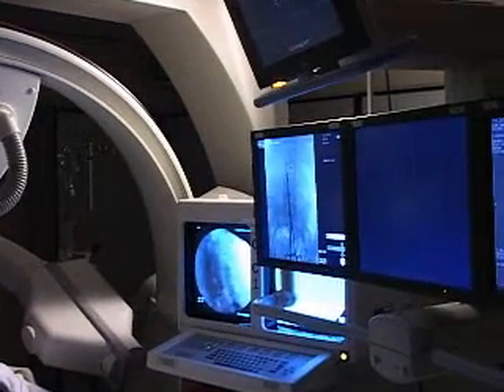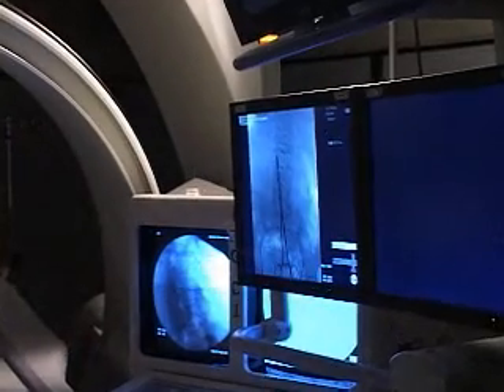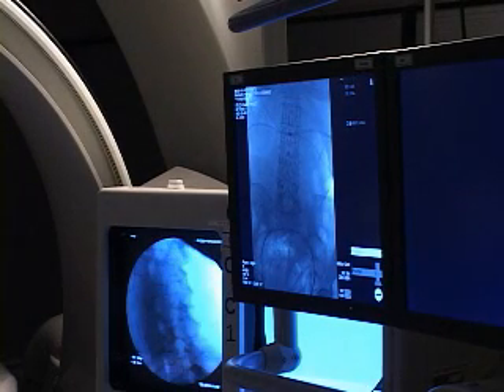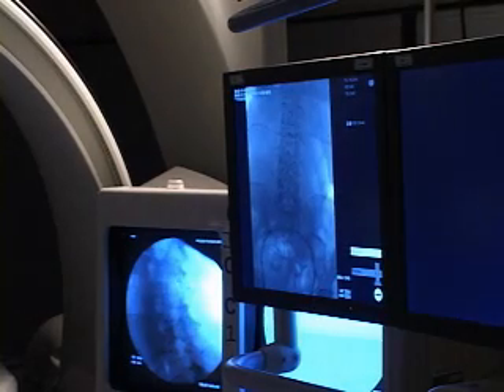Setup is probably one of the most important things in what we do. It just makes your job a lot easier as you do these procedures. I like to get the pedicles aligned as well as the superior endplates.